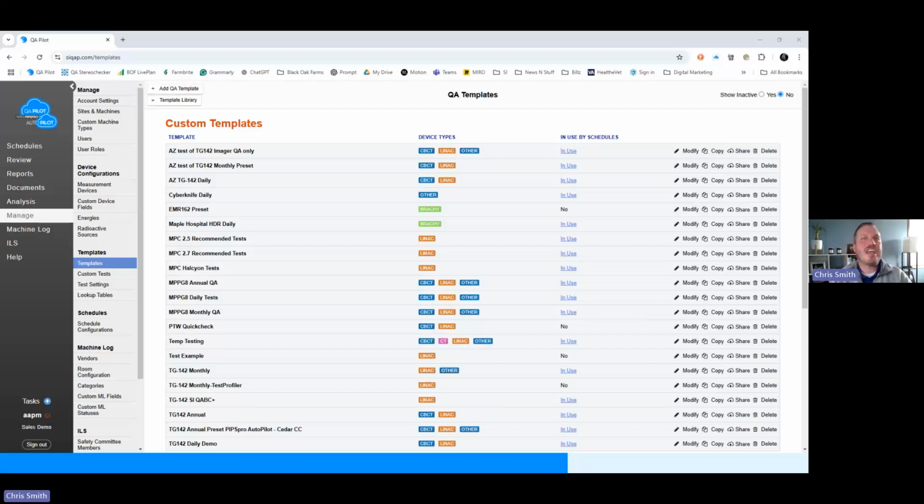So the change management piece is in lockstep with our consultative approach to making sure that you have good daily and monthly analysis and a central repository for all of your data. So I'd be happy to talk, and really give us the opportunity to have a chat with you, even if you don't end up wanting to buy anything. That's great. We still want to talk with you and learn more about you and your clinics and where we might be able to make some inroads on some of your pain points and make it a bit easier for you.